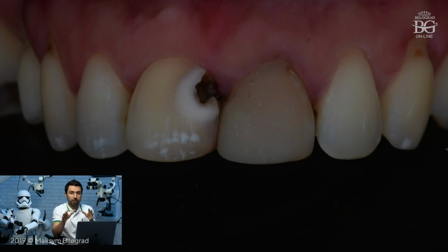Okay, orthodontic treatment was refused by the patient. So the second option that I offered is that we need to do crown lengthening. In that case, with such a deep caries defect, crown lengthening is a good option, because again, if you redesign biological width, you may get a really good outcome and a good architecture of the soft tissues afterwards, because all of us, we saw some patients with crowns and with a red or even some kind of bluish gingiva around the crowns, not because the crowns are PFM.